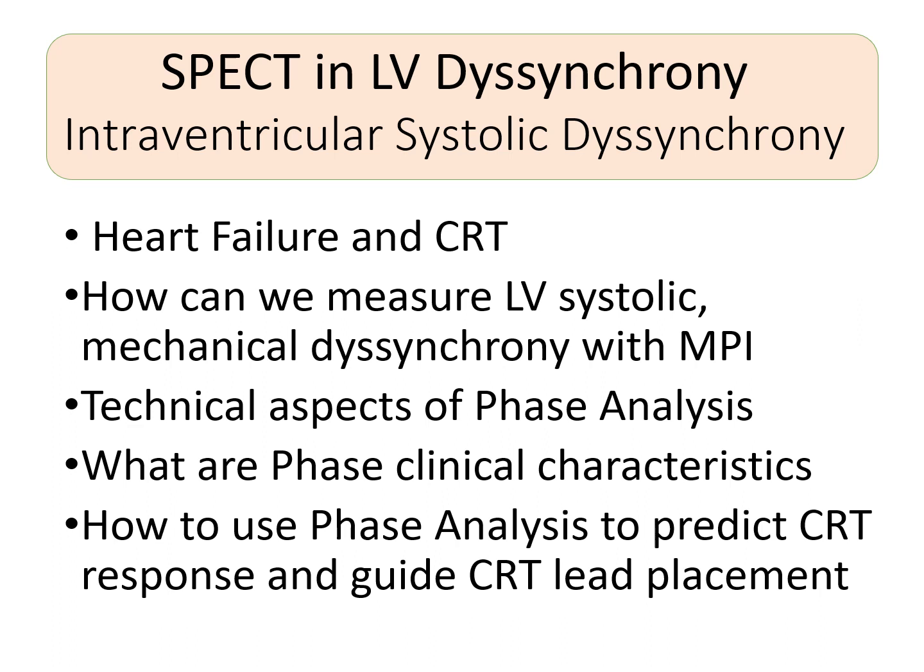So here what we're going to look at mostly is SPECT MPI, the use in LV dyssynchrony, specifically intraventricular systolic dyssynchrony. By intraventricular is meant just the left ventricle, the dyssynchrony or synchronicity within the ventricle. And by systolic, it's really looking at the onset of mechanical contraction.